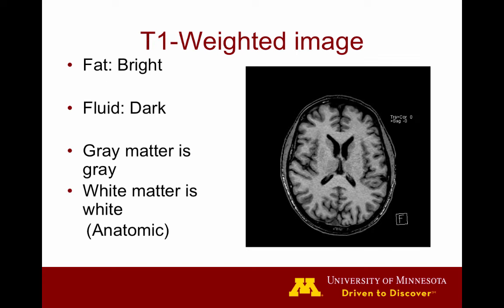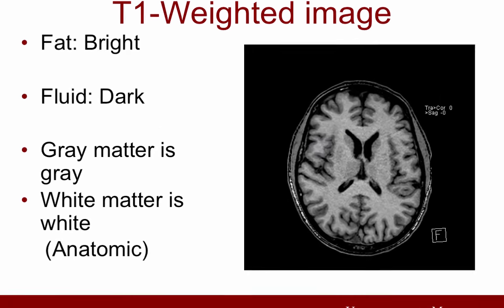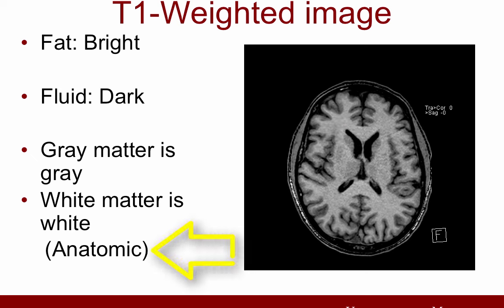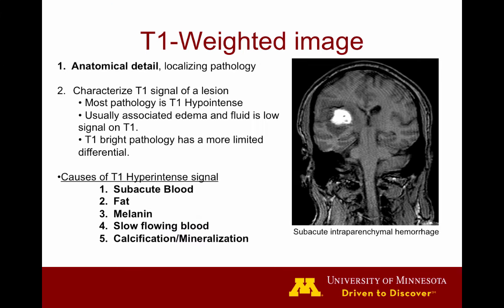This is an example of a T1-weighted image. You can see some subcutaneous fat that is bright, the CSF signal is dark, the gray matter is gray, and the white matter is white, which you can remember is anatomic — gray is gray and white is white.